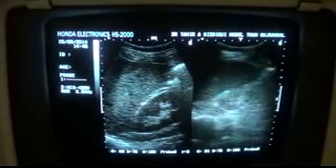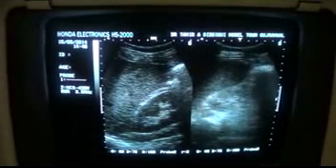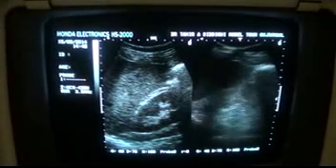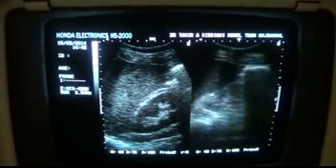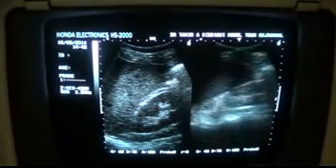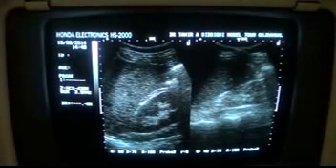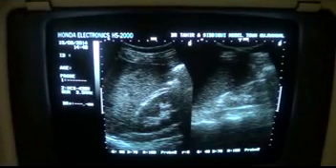You can yourself make out by the description I have given you. I'm trying to get the longitudinal section. So now you see that this is the parenchyma. No corticomedullary differentiation. Why? No pyramids or cystic areas are seen in the region of the pyramid.